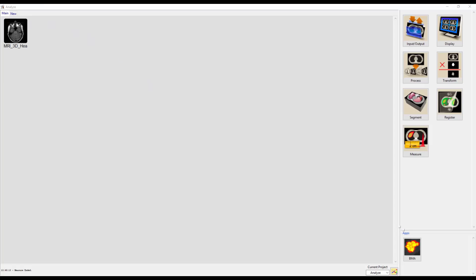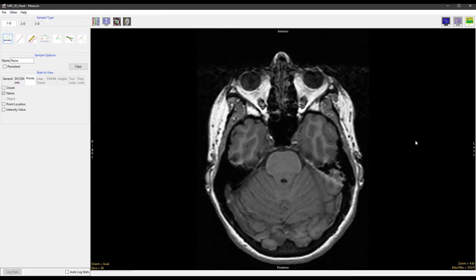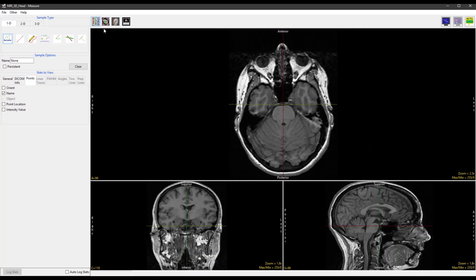To start, select the dataset and open Measure. Select Toggle all orientations so that all three orientations are displayed. And then in the Controls layout, select No primary image.